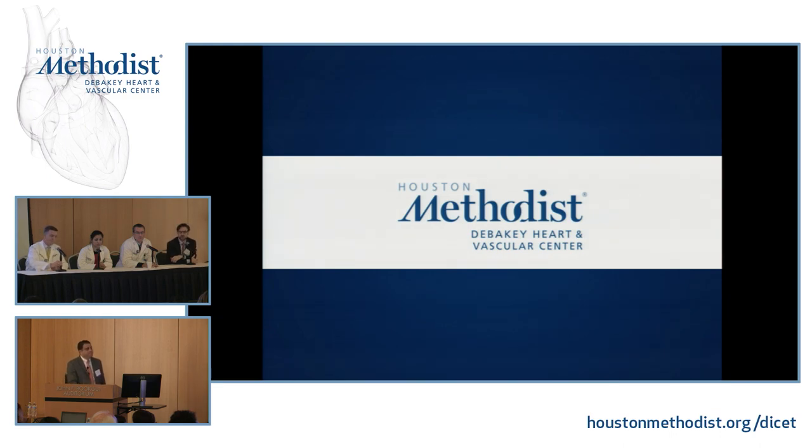Yes, I agree. Dr. Little, since you were involved in a lot of these patients and saw them in the echo, doing the echo while they're getting the procedure and helping guide the interventionalist, any comments on anatomy that was challenging? Is there an LV size that is too big to really benefit from a single clip? How often were you doing more than one clip? So we've done somewhere close to 200 mitral clip patients, and I think our collective average is about 1.7. So most patients end up with one or two clips. With a functional case, you're more likely to require two clips. That's not really the challenge of the case. The most challenging element of this whole treatment paradigm is picking the right patients.